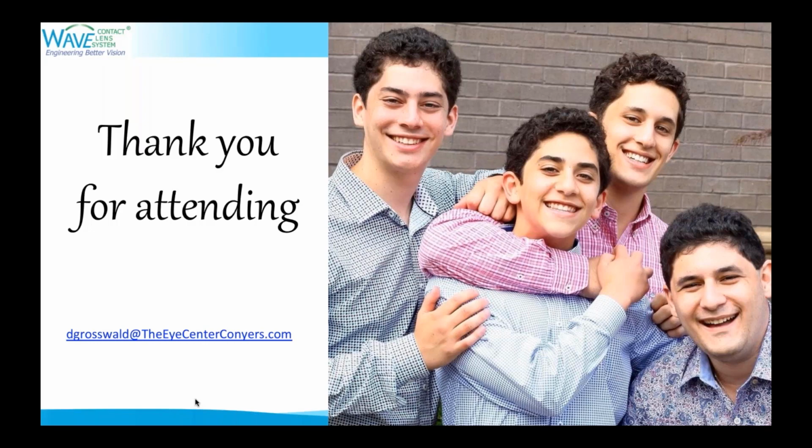Our next question is, do you use prism if there's too much predicted cylinder? So once you know with the Pentacam the sag value at the specific chord, the overall diameter, right then and there, based on the difference, you can tell if it's going to fit like a Pringle potato chip on top of a Pringle potato chip, or if there's a great deal of asymmetry out in the periphery, in which case I will use a prism ballast, and I think Hydrapeg makes a difference for the prism to return to the bottom. But again, I'm using far less prism with the Pentacam derived lens than I use with the corneal data extrapolated out onto the sclera.